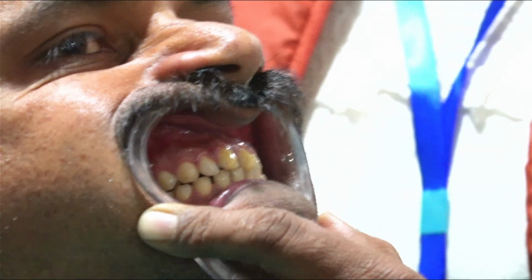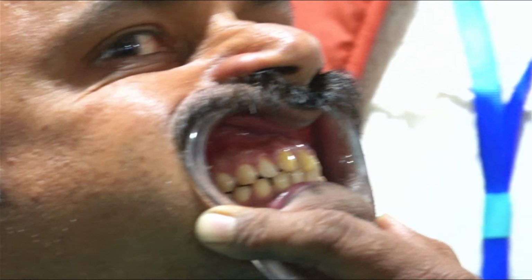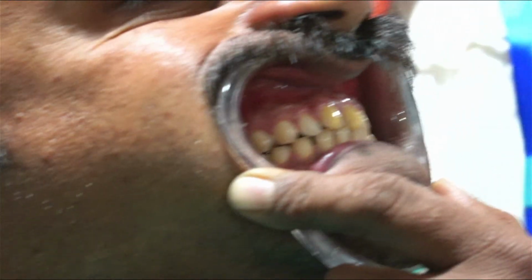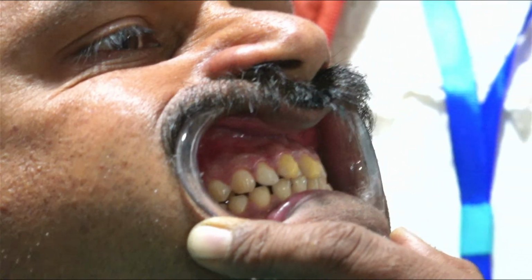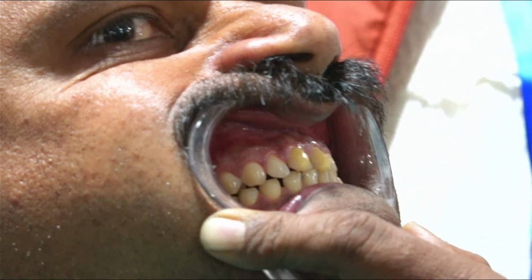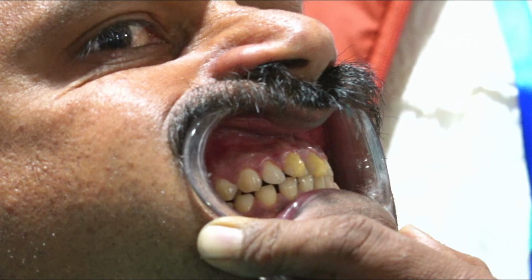So if I am using a single teeth, I could have used this. Now I am using two teeth. I can use the prism. So what watt? कितना watt prism के लिए?